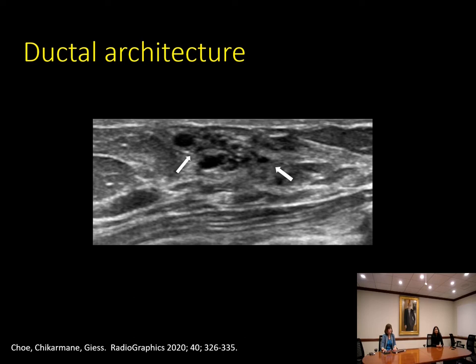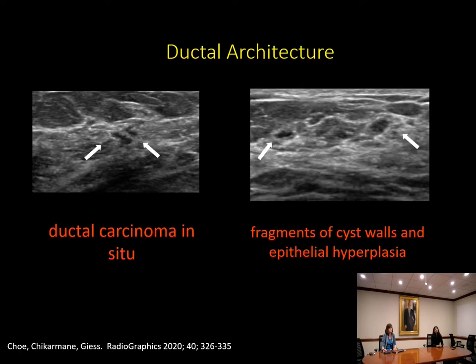Ductal architecture occurs in a number of the proposed classification systems. This is an example in a 25-year-old with a palpable finding — she has small anechoic areas aligned in a linear distribution suggestive of a duct, with some larger outpouchings or cystic dilatations around the duct. Two more examples of ductal architecture are shown: the image on the left is DCIS, with small anechoic areas aligned in a linear distribution, and a larger area with smaller anechoic oblong areas suggesting a ductal orientation directed towards the nipple.